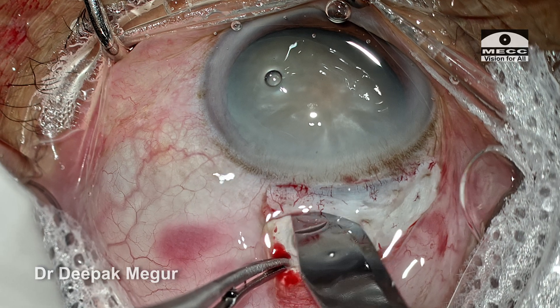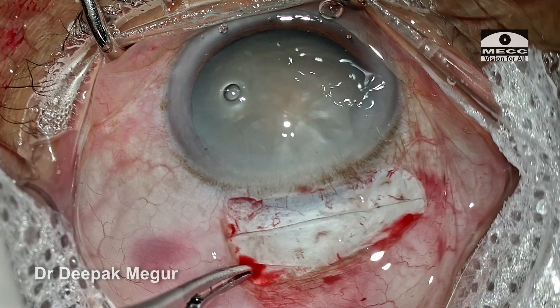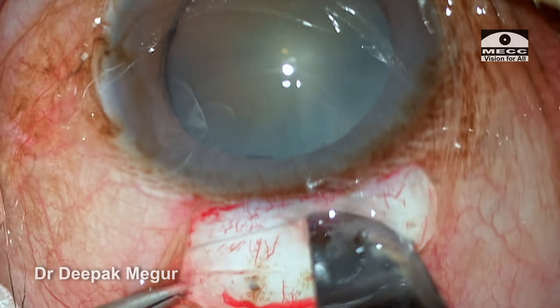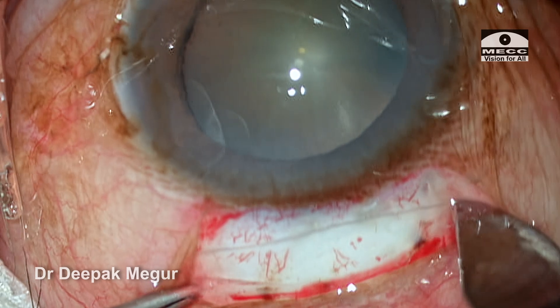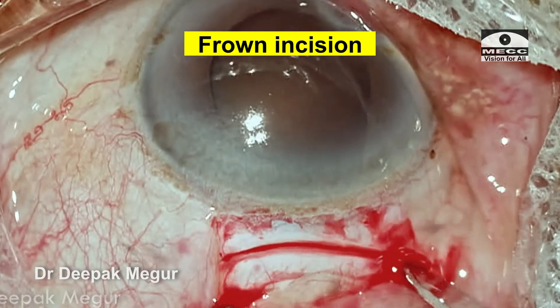Coming to the length of the incision: in the initial learning curve, one can use a slightly longer incision as it would ensure easy nucleus delivery. With experience, one can reduce the incision size. To begin with, you can use a straight incision, and after a few cases, you can do the frown incision.